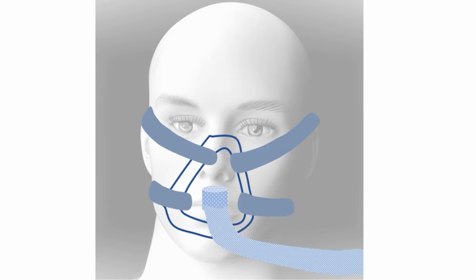The advantage of non-invasive ventilation is that the individual can remain fully alert without any need for sedation or anesthesia. There is no need to place an endotracheal tube and hence can be initiated quickly by minimally trained persons. Alarm settings have to be adjusted for the needs of the patient to avoid unnecessary alarms.